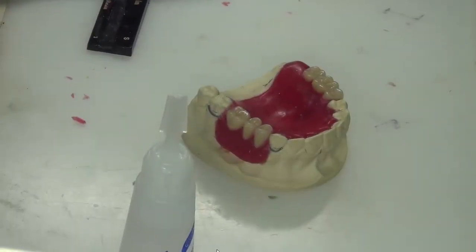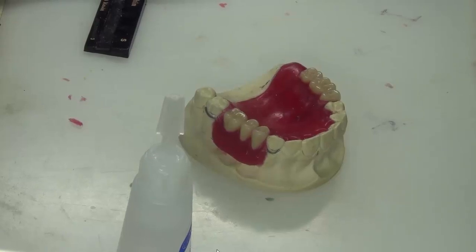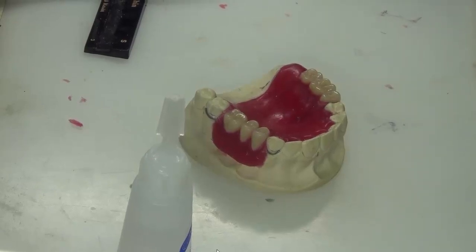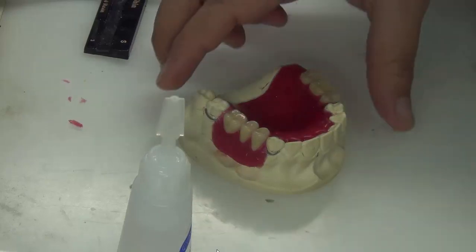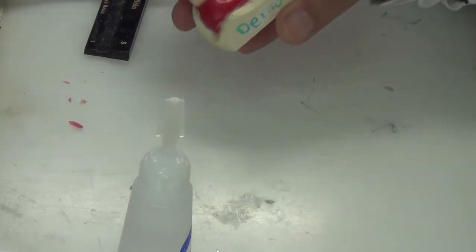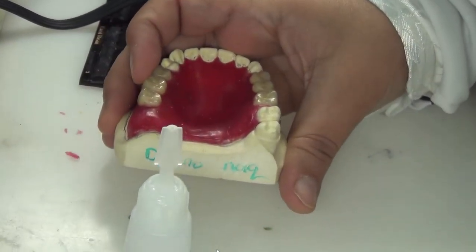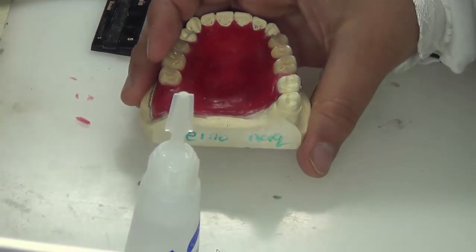Okay, Assalamu alaikum. So the first step we're going to do for the procedure of flasking of a partial denture is the following. First of all, we want to make sure that the wax is bound to the cast firmly, okay? We want to make sure that at all edges of the wax, there is no space.